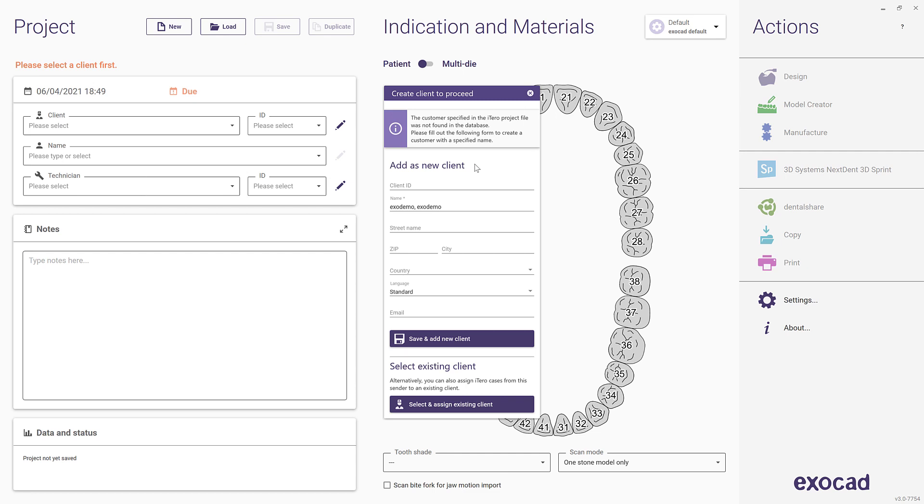Note, My iTero maintains a database of doctors, whereas in the ExoCAD software they are referred to as clients. The first time you import a case from a doctor, you will be prompted to map this iTero doctor to a client in the ExoCAD software. Future cases from this doctor will automatically be assigned to the client you have chosen during the initial mapping.